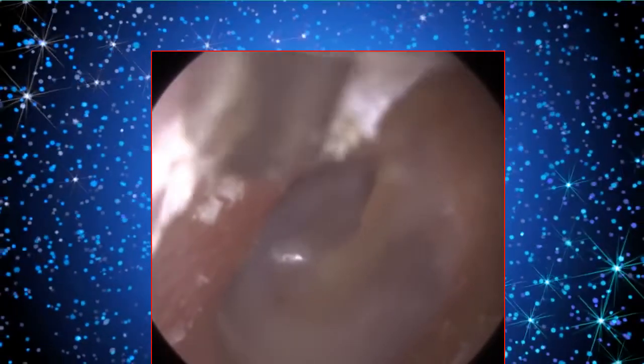We're quite lateral near the entrance. The skin adhesions here are quite strong. I always compare dead skin keratin to double-sided sticky tape. So typically you have one side when it comes to the ear that sticks itself onto the surface of the ear canal, and the underneath side quite often envelops itself around the plug of wax. And when we're peeling the skin, imagine you've got a postage stamp on a letter, and you're trying to gently peel that off without tearing the envelope itself. And that's what we're doing in the case when we peel the dead skin of the ear. So it's a very delicate procedure. It requires a lot of finesse and obviously a steady hand.